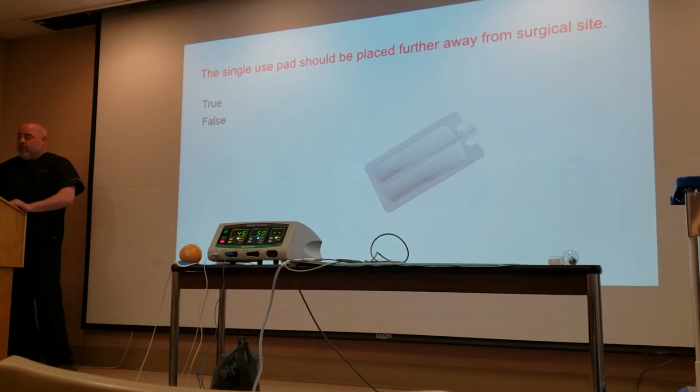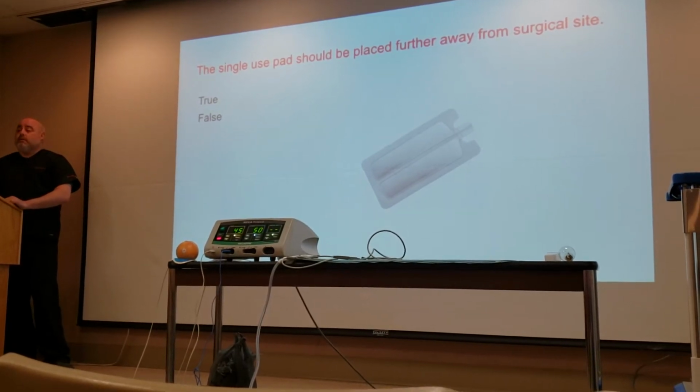A single-use pad should be placed further away from the surgical site. True or false? False, exactly.